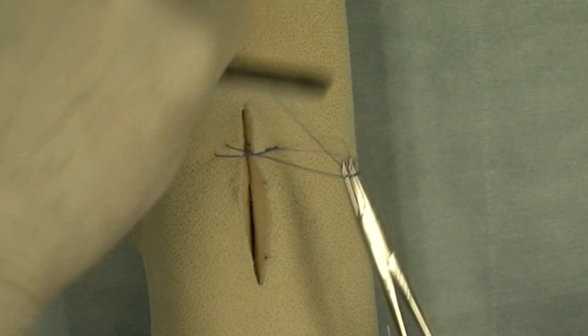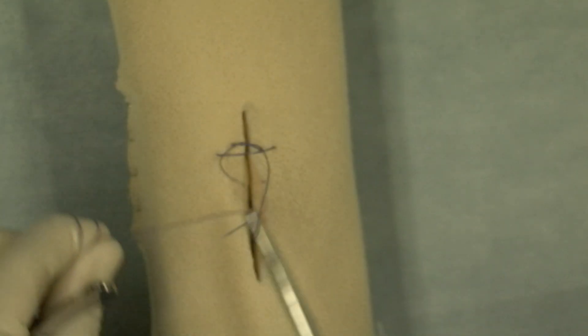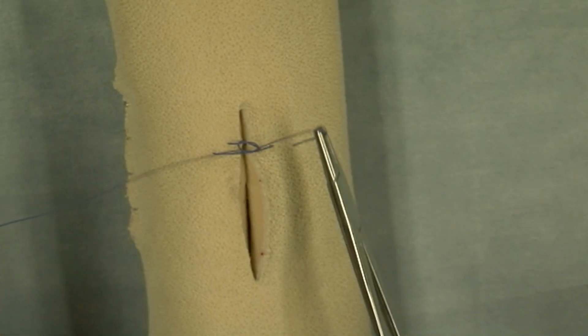And so this is performing a square knot. You can see that the tension is not taken up very well with just a simple square knot.